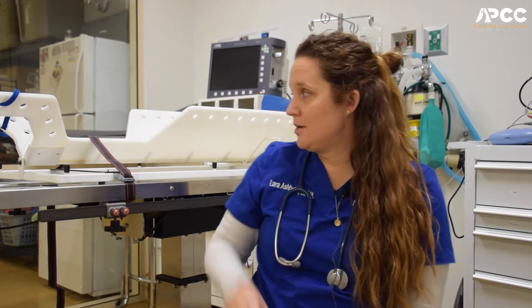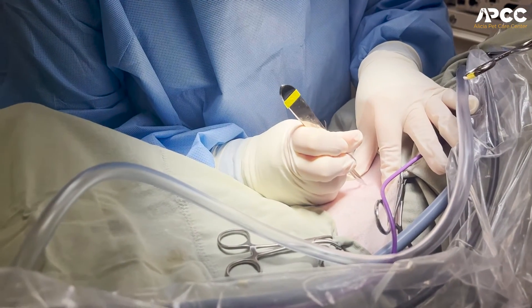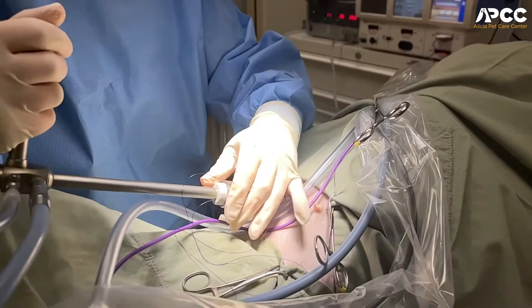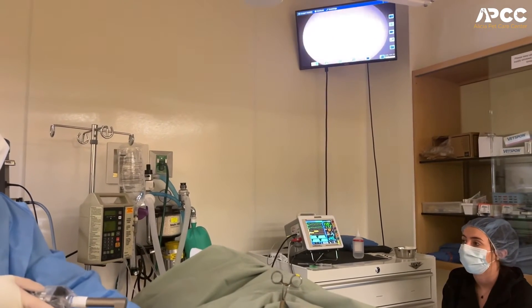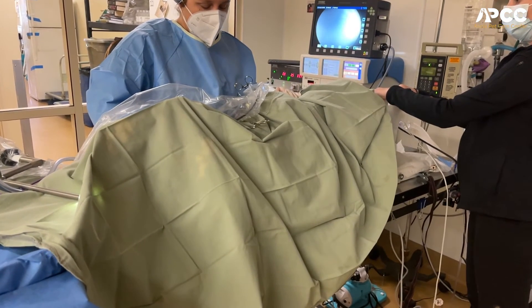First, the pet is put into one of these tables called a tippy table and secured. Then for the procedure, we actually make a centimeter incision just caudal to their umbilicus, on their ventral abdomen — and all we need is a centimeter because that's how big the scope is that's going to go in. Once we get all the way through, we are able to insert the laparoscope, and we inflate the abdomen using CO2. With it inflated and with the scope, we're able to see everything through the camera on our screens to see everything inside the abdomen. Because there are lots of organs in the abdomen, we actually use this table to gently tip them to the side, which helps make sure all the intestines and everything move out of the way, and we're able to easily identify the ovary and the uterus.